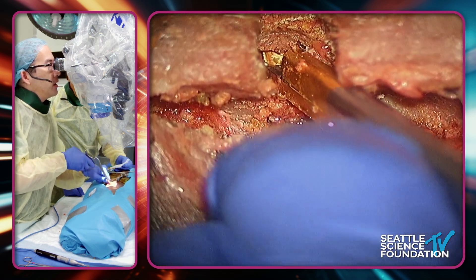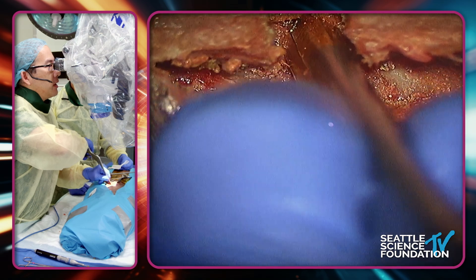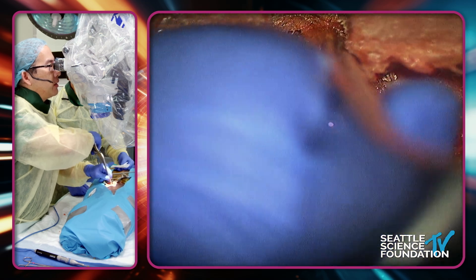See how I sneak under there? I try to do these quick bites before I actually see the thecal sac because I want to work as quickly as possible, but I really want to avoid any spinal fluid leak.